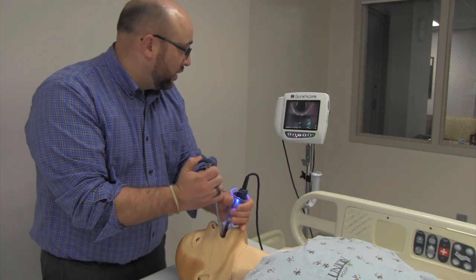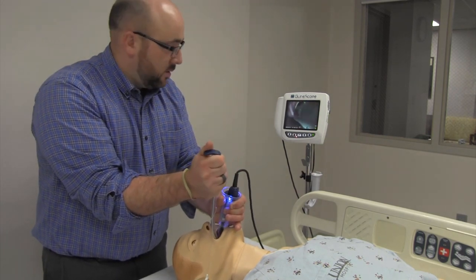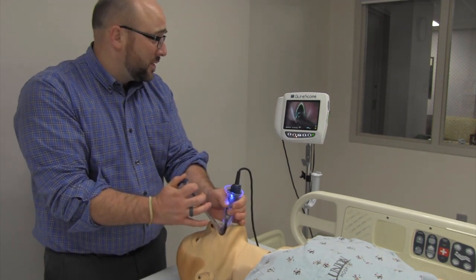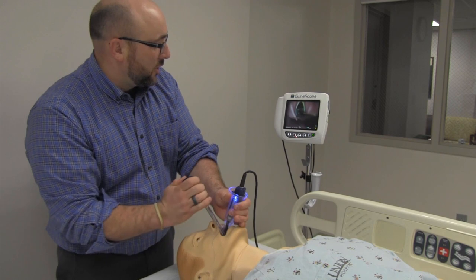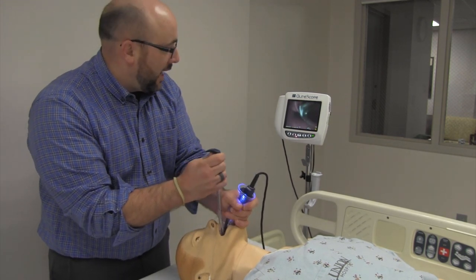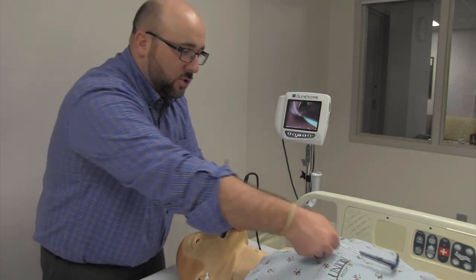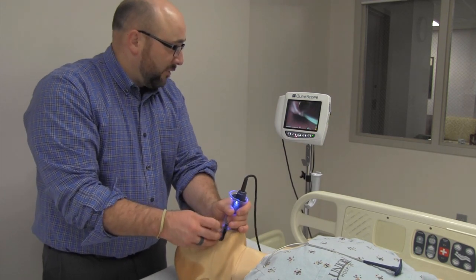Back at the monitor for step four: I can see a big cuff in my way, the tube is going toward the stomach, so I pull it up and push my thumb to the right to get it past. At this point I can usually push and it's stuck at the cords. Don't smash the posterior glottal area — go in and pop it. The tip is inserted; I pop the stylet out, advance, pop, advance, then I watch it go in and pull the stylet out toward the chest. The endotracheal tube is in — buried way too deep in this mannequin, so I'd withdraw to about 24.